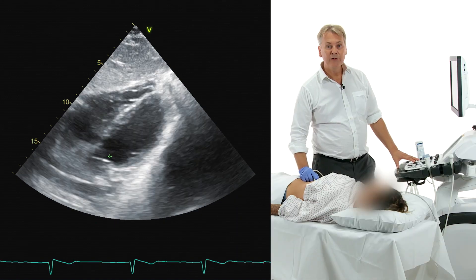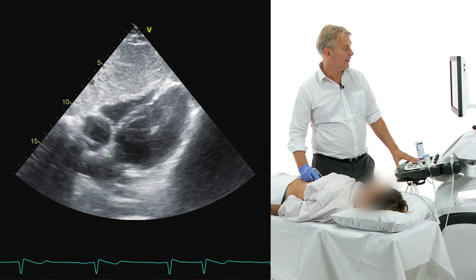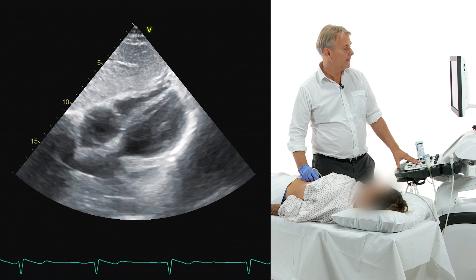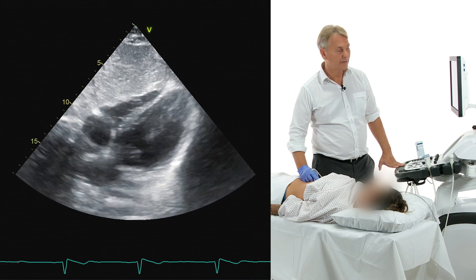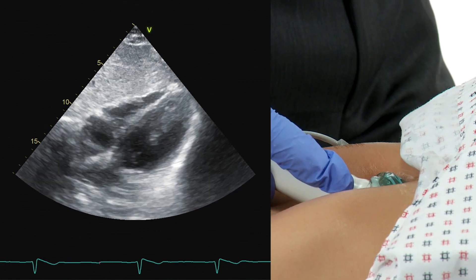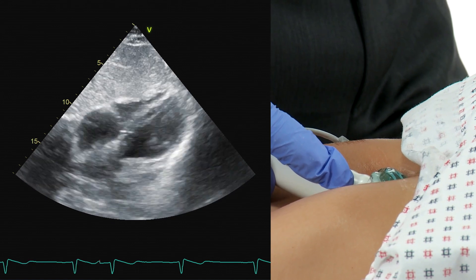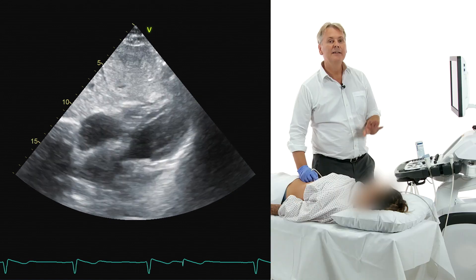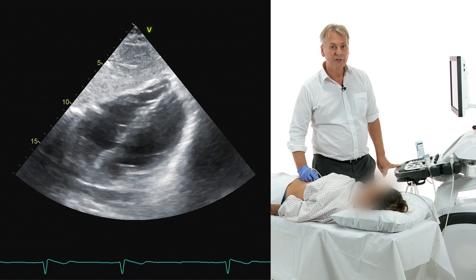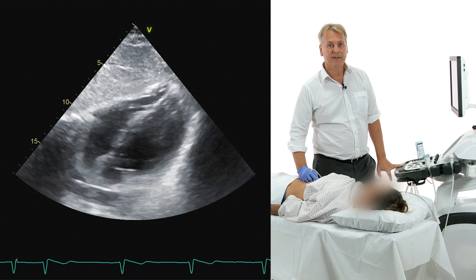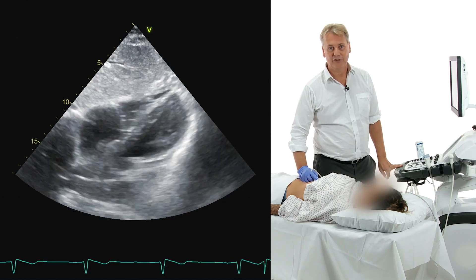The four chamber view is ideal to image the interatrial septum, which is a very important structure when looking for atrial septal defects. In the subcostal view you have a perpendicular orientation to the defect. This is why the subcostal four chamber view is one of the most important views when studying atrial septal defects, which will be covered in the chapter on congenital heart disease.